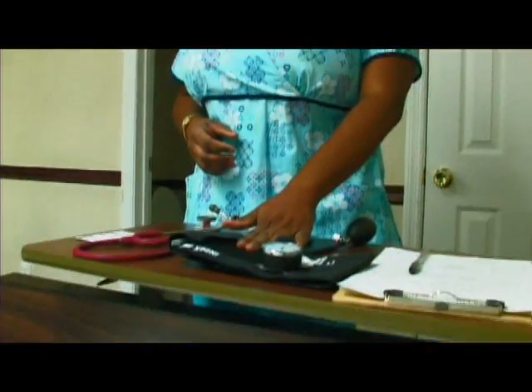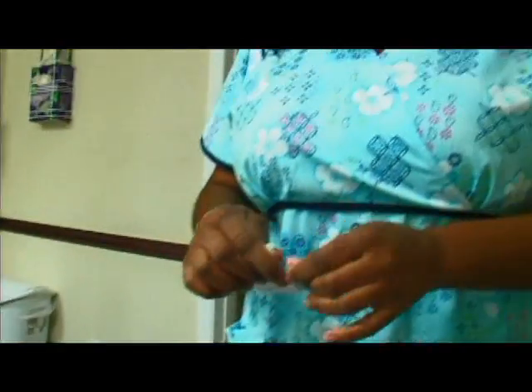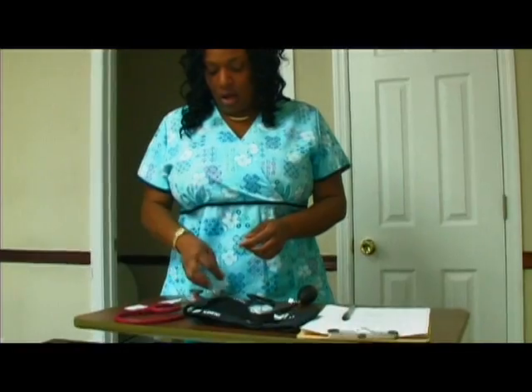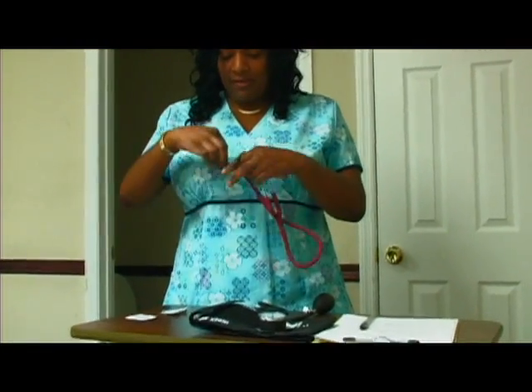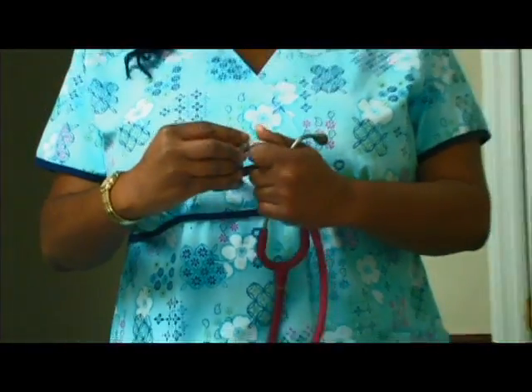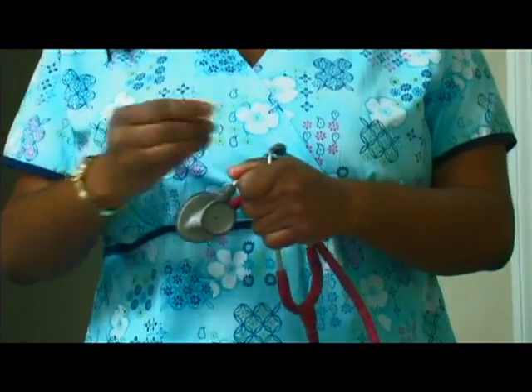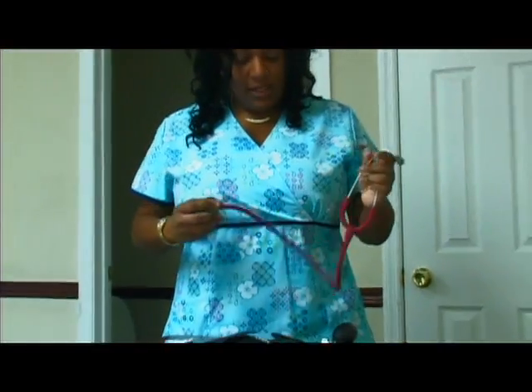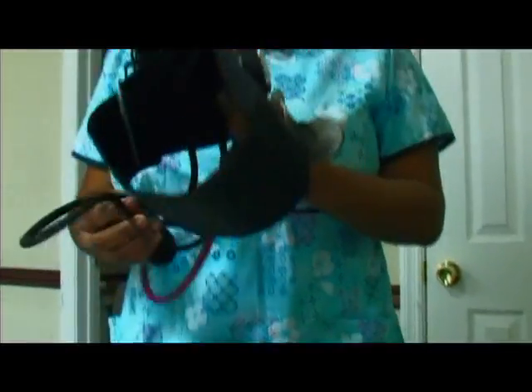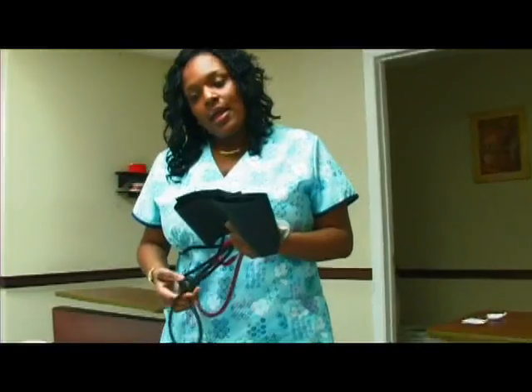To take a blood pressure, select the appropriate size cuff based on your patient's or resident's arm size. You'll need a blood pressure cuff, your stethoscope, and alcohol. Clean the diaphragm of your stethoscope as well as your earpieces. If using a double stethoscope, make sure you clean your earpieces and the instructor's earpieces as well.